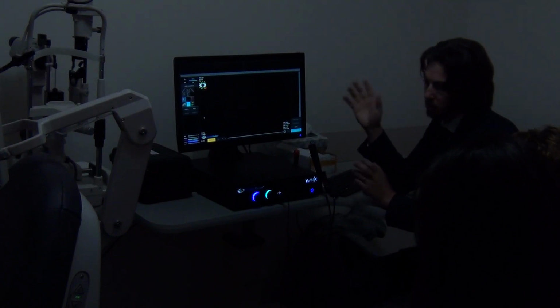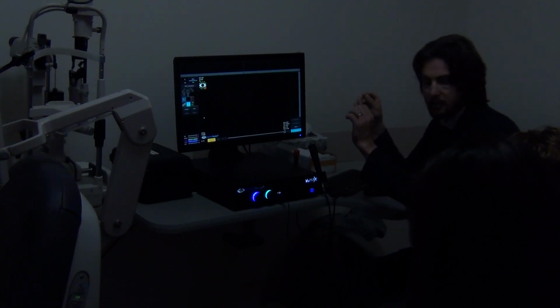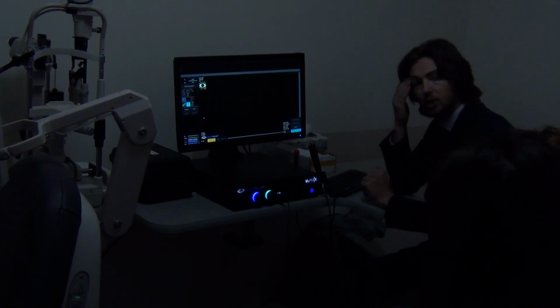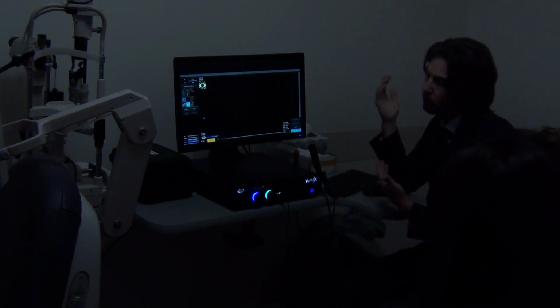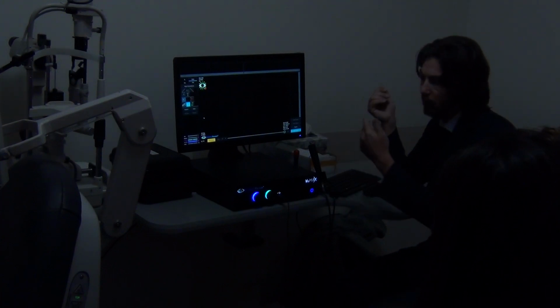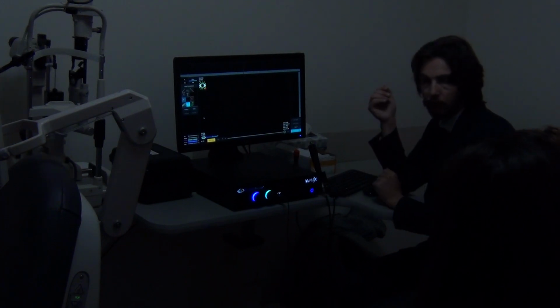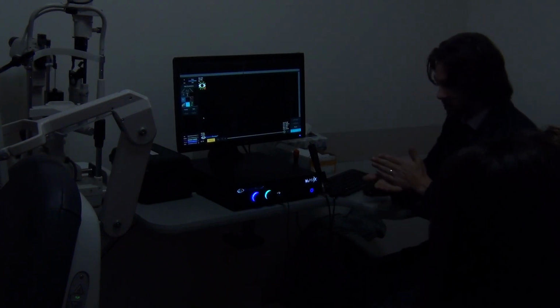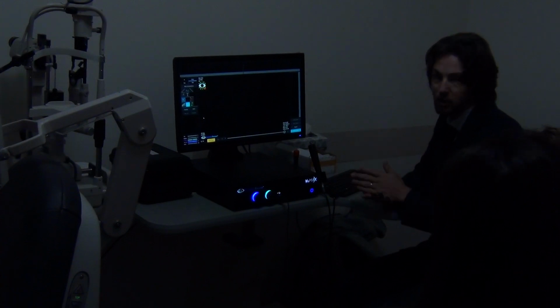Most of these numbers are kind of guesstimated numbers by the software, and once you post the image, you always can readjust the lines if you feel like the adjustment is needed. Because it's a little bit hard to find like perfect sulcus to sulcus, it's always recommended to have multiple loops, just circling through and look at the criteria, because you could be just slightly off center, and it's hard for you to catch, right? To see, am I exactly on the axis or not?